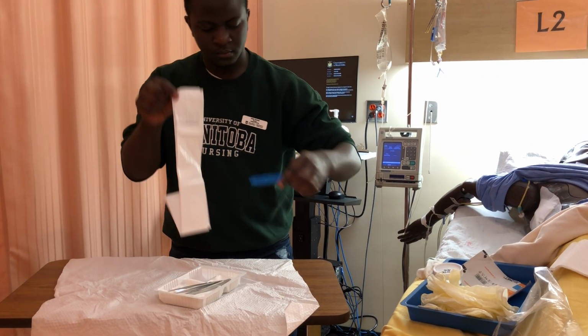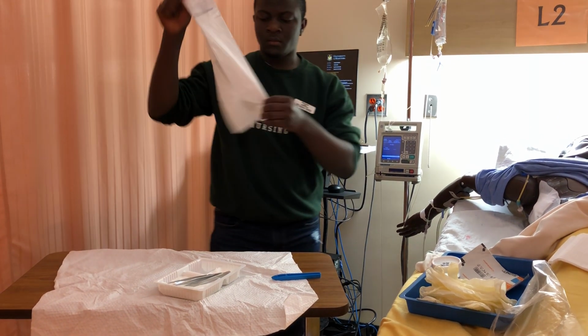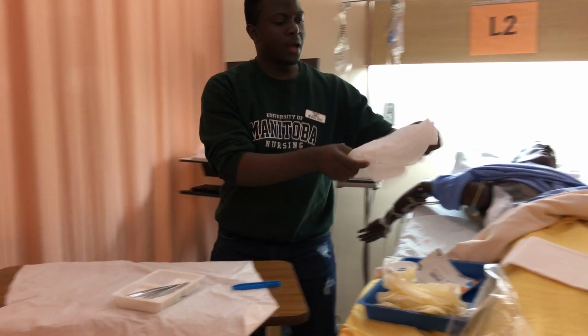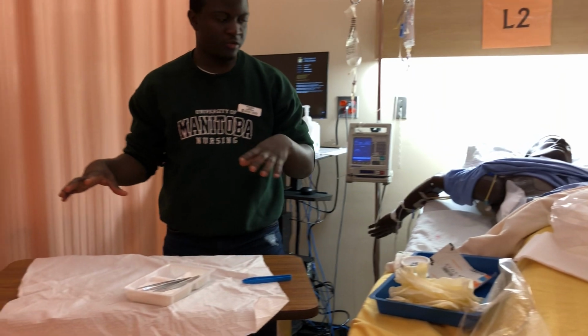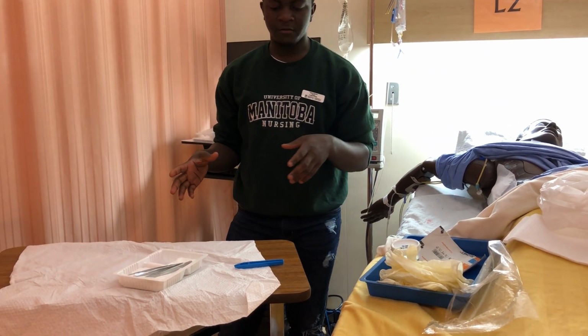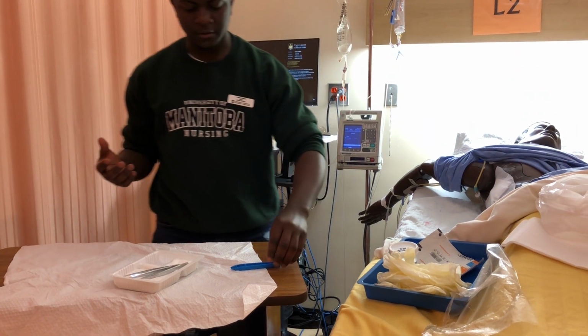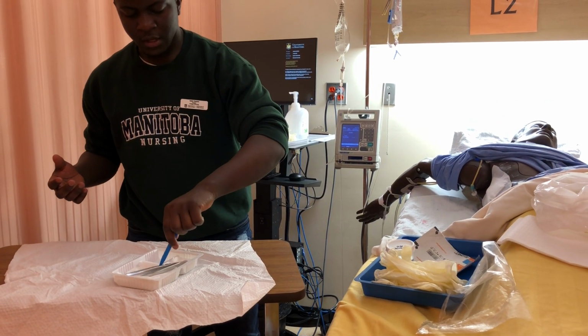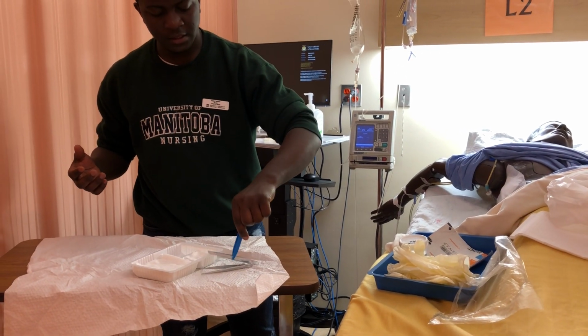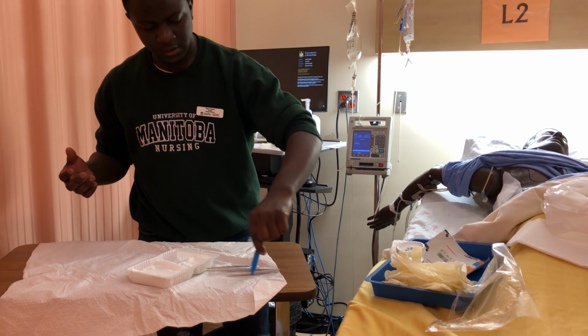And now I'm just going to push on the end, and when I push on the end, it should go between 80 and 100. And notice that I'm setting my tray in front of me and making sure that I can walk between the patient and my sterile field without turning my back on the sterile field. I'm putting it at a good level so that I can access it without breaking sterility.